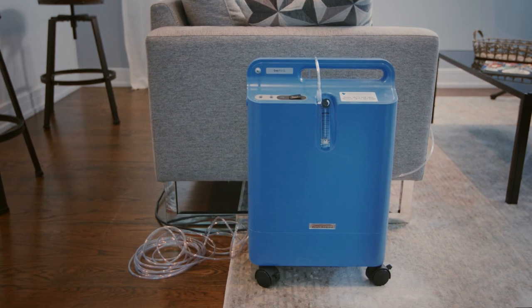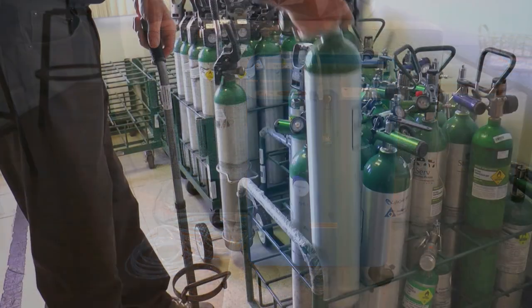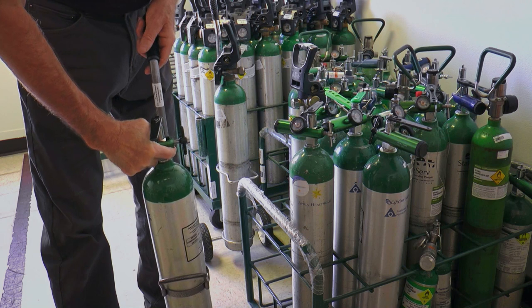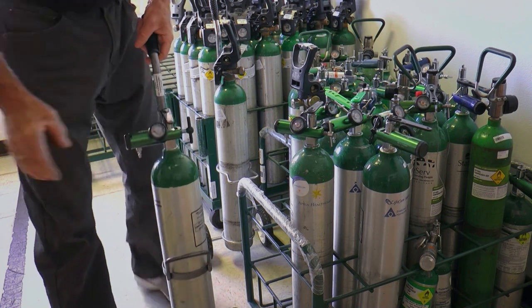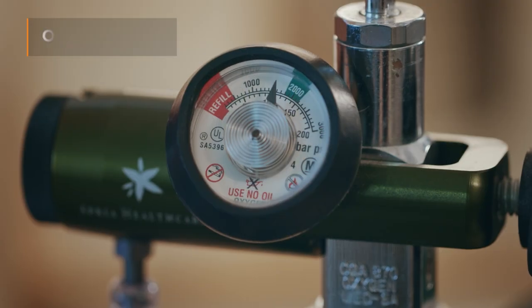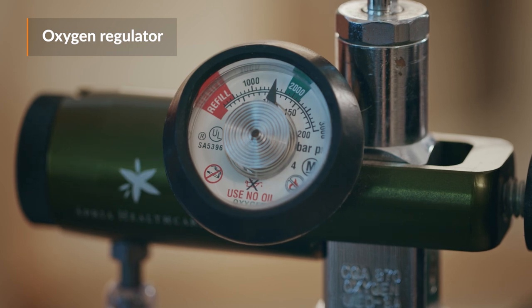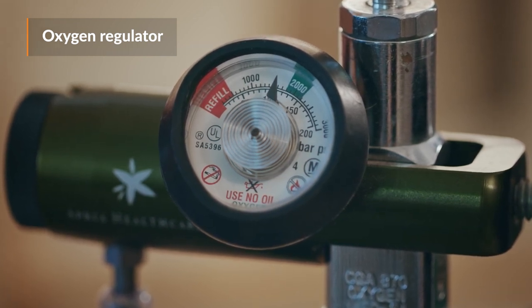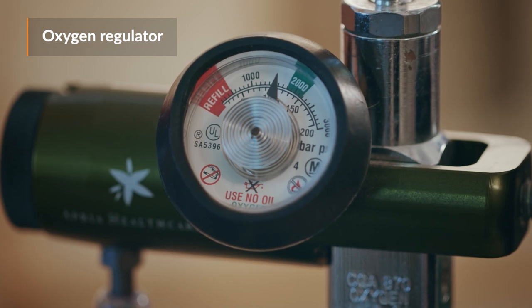If you use a home concentrator, your supplier might also provide you with a large backup metal tank that can last 24 hours should the power go out. Your tank will have an oxygen regulator that shows you how much oxygen is left in your tank. Keep your eye on the regulator so you know when you're close to running out of oxygen.